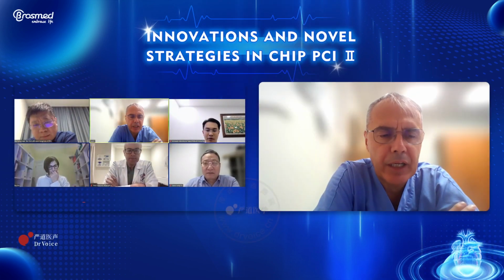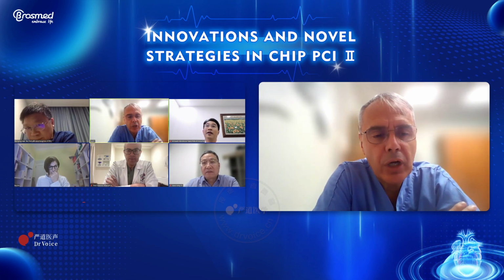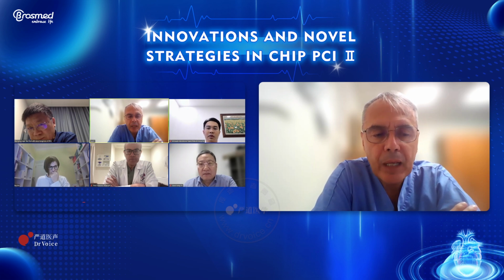Thank you, Dr. Zhanying. It's a fantastic case. They demonstrate how to cross. And I believe, honestly speaking, regarding my comment on the RCA, probably after Revo Edge, especially in the portion of DCB, we go more aggressive with the balloon. Nevertheless, the result after 1 week is outstanding.